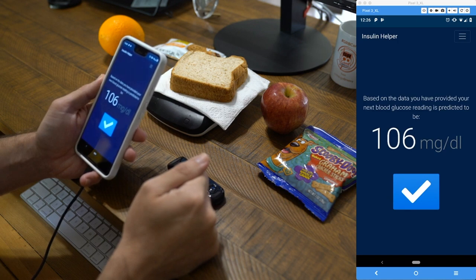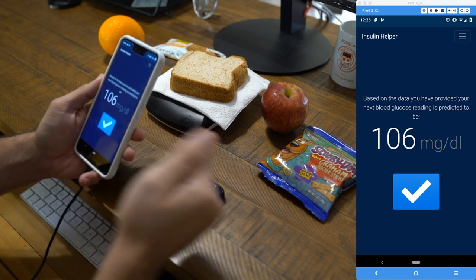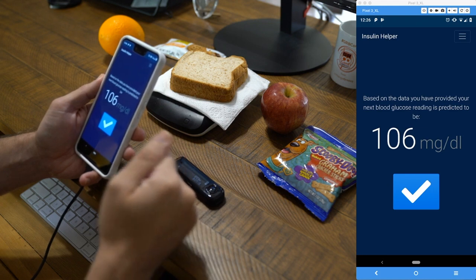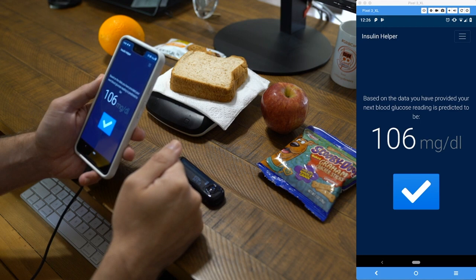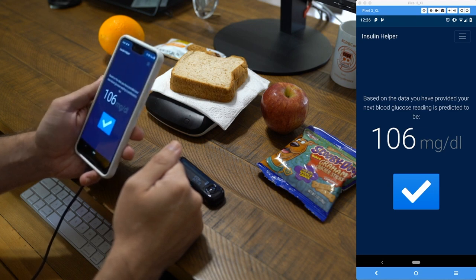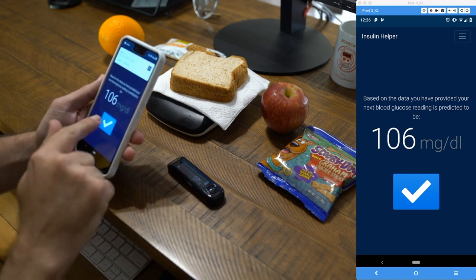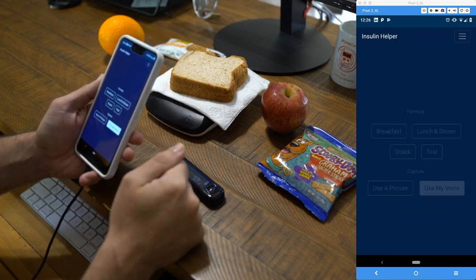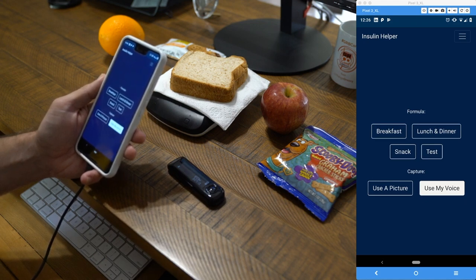Next, we get a prediction based on all previous inputs entered into the system. Some machine learning is applied, and it says that based on the data provided, the next glucose reading is predicted to be 106 — pretty good. This gives us the ability to spot potential danger spots coming up, like if we're eating too many carbs at this meal. We confirm that and we're all done. That's the Insulin Helper application, created to make life a little easier when calculating insulin dosages.